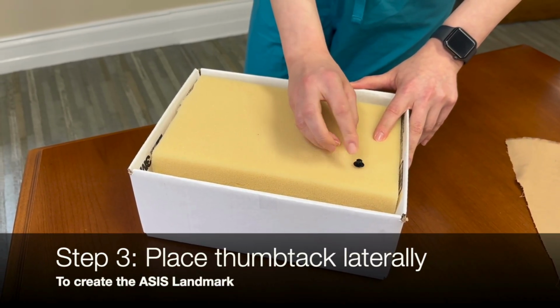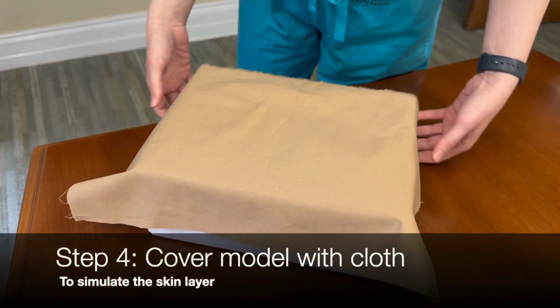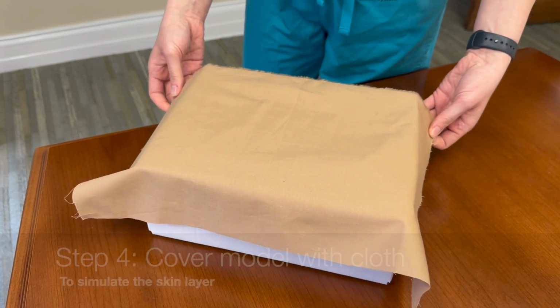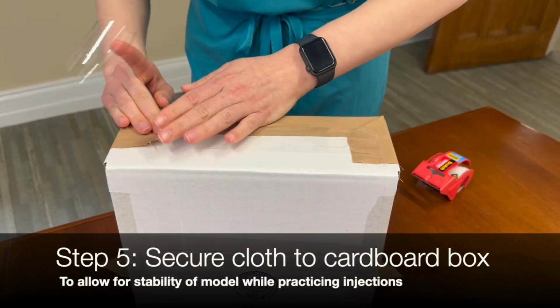Mark the ASIS with a thumbtack and cover the entire setup with cloth to simulate the skin. After securing the cloth skin with tape, you will mark your landmarks that we previously reviewed.